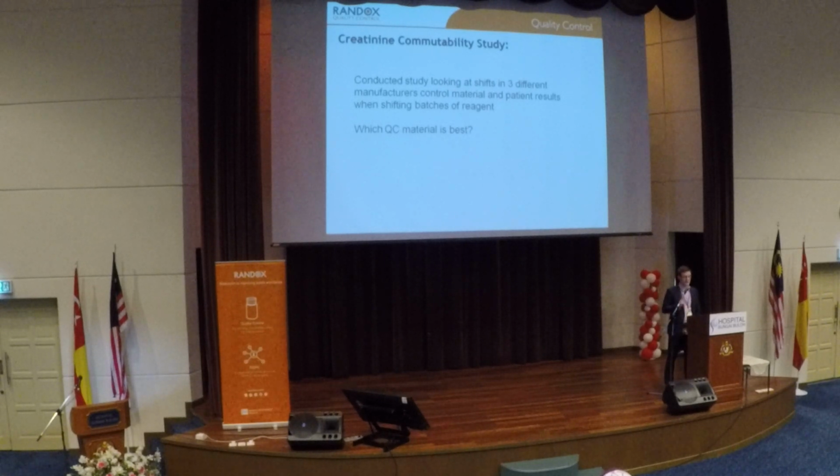In this next case study, we were looking for creatinine commutability, and we looked at shifts in 3 different manufacturers' control material and patient results when shifting batches of reagent. It's important to remember that when we change our reagent batch, there will generally be a slight shift in the performance of our patient results.